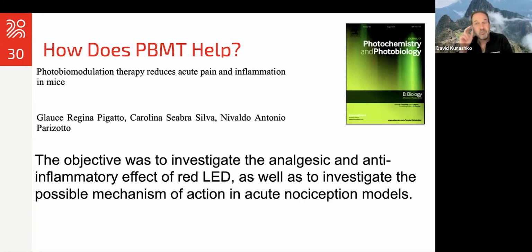So interesting enough, they used red LED. And I wanted to mention that because some people are just like, oh, it has to be laser, laser, laser. It's like, no, it's called photobiomodulation because LEDs can be very helpful. And when it comes to treating rib issues and everything, LEDs are quite beneficial because issues aren't that deep and usually it's a big area. So having LEDs is quite helpful.